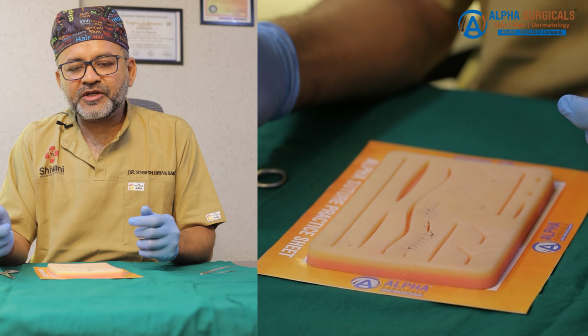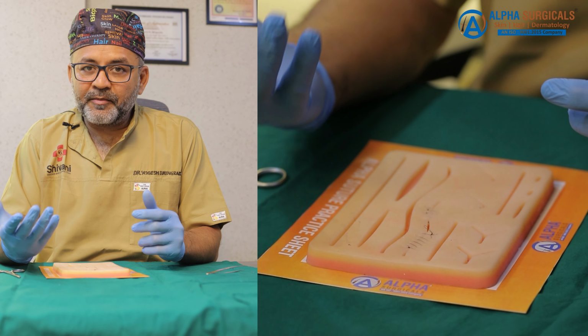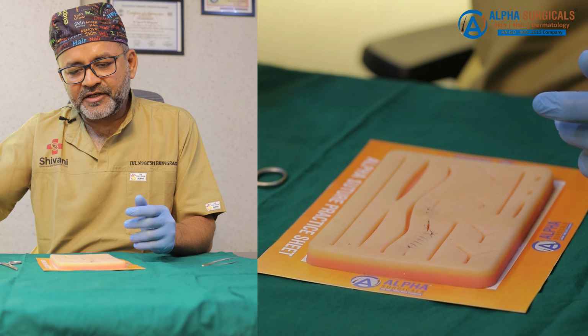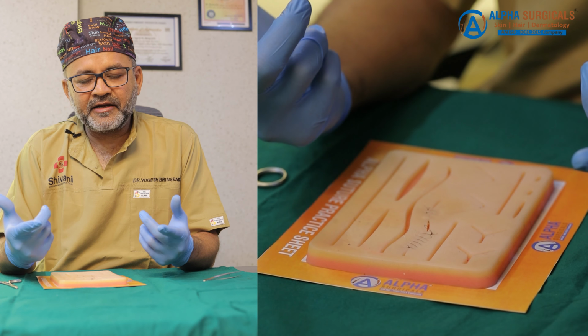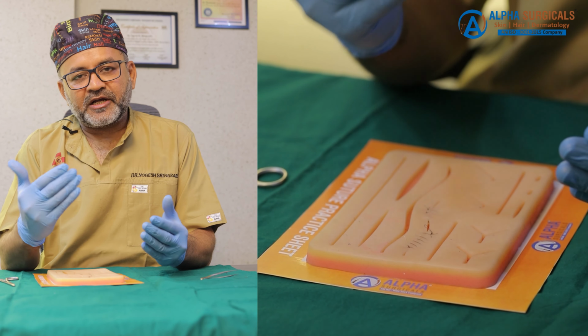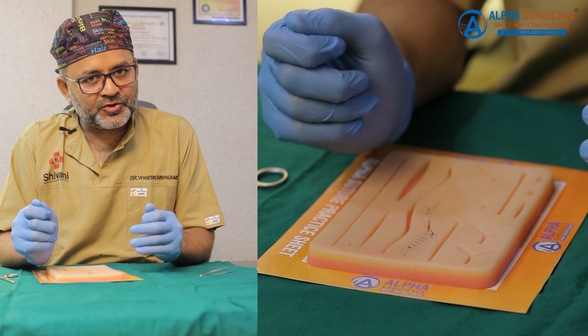Each and every suture is creating pressure, which will probably give you necrosis of the margin, but in the running continuous suture, pressure is maintained evenly throughout the length. So no strangulation of the blood vessels, and the vascularity will be maintained inside the tissue. So chances of margin necrosis will be minimized.